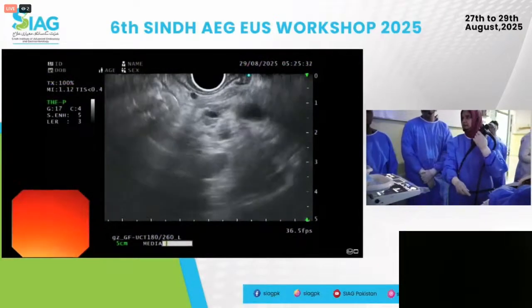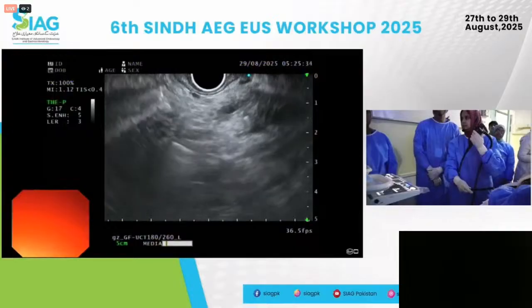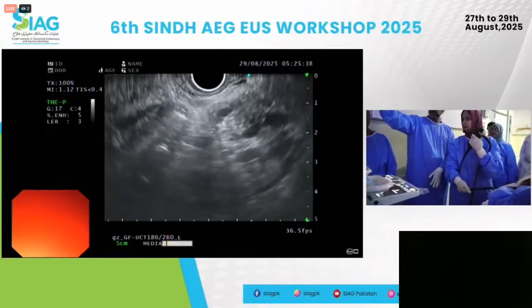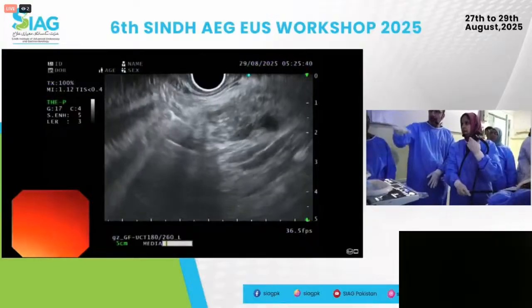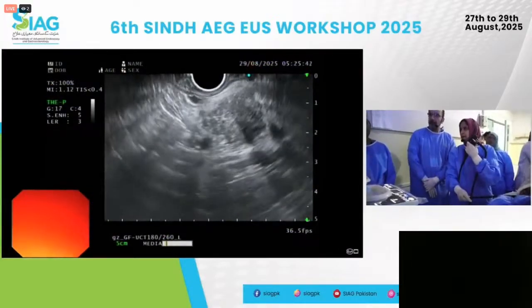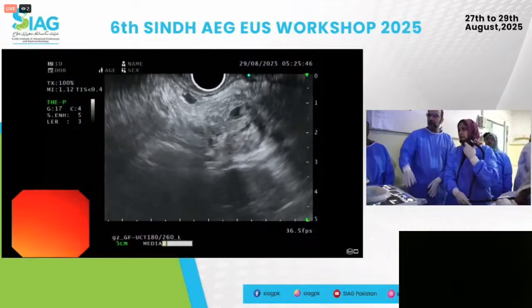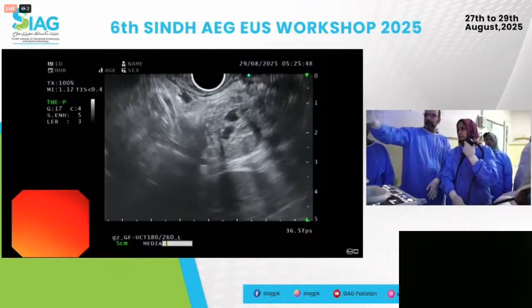Good. So I'll keep chasing BD now. Yeah, we're not chasing it, we're following it, right? Yeah. So go counterclockwise. Okay, good. Now pull back on it a bit. There, and keep going clockwise. Good. So a lot of abnormal parenchyma here. Yeah. Keep pulling back.